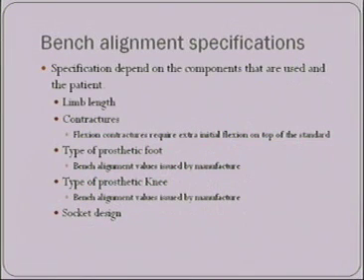So here are our bench alignment specifications. Specifications for bench alignment depend on a few things. First off, on the components that are used. Manufacturers are going to have components that they have bench alignment values for. And then there's also your patient. So different patients will need different bench alignments.